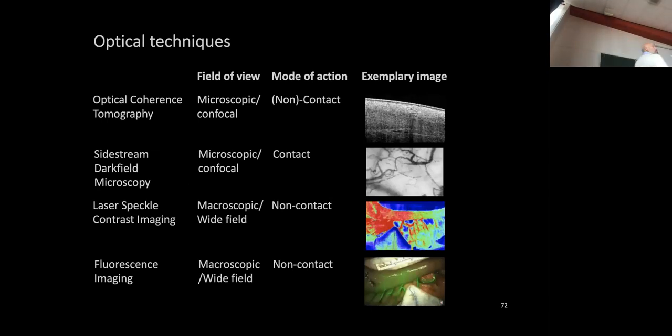We had 4 optical technologies during surgery to test this. You can imagine that this surgery is already quite crazy with everything that's going on there. And on top of that, we had 4 big systems in the OR, used on the patient sequentially after each other to see which one of the 4 is actually best to continue in the future.